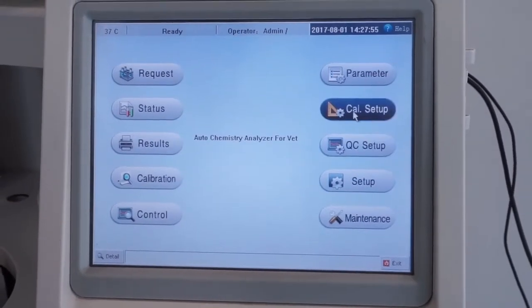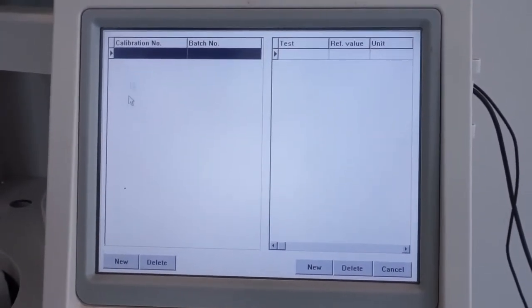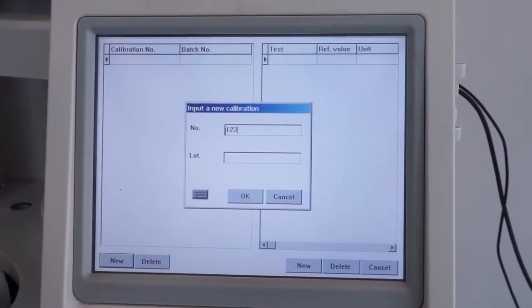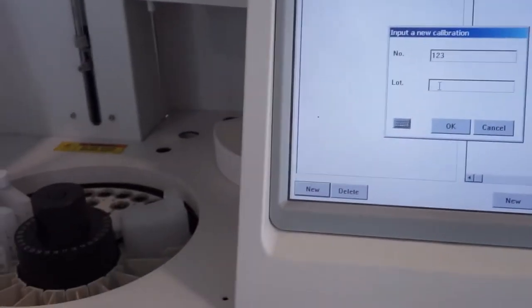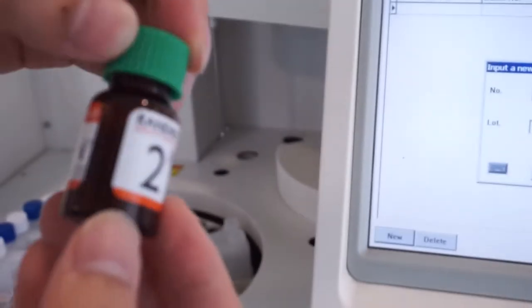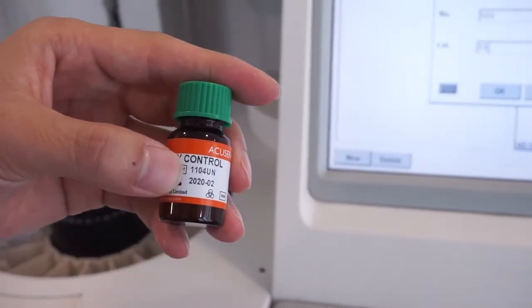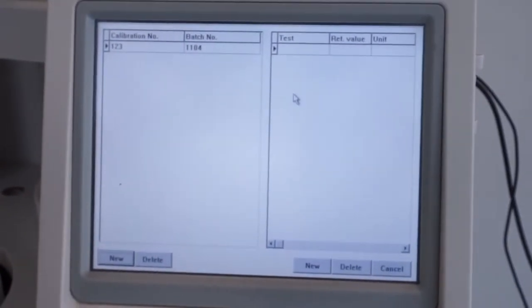So we go to here, calibration setup. For the calibration, we click new. Input number, for example, 1, 2, 3. And the row number, as we can see, we have a random calibrator. In the lot number, you can input 1104 in the software, and click OK.